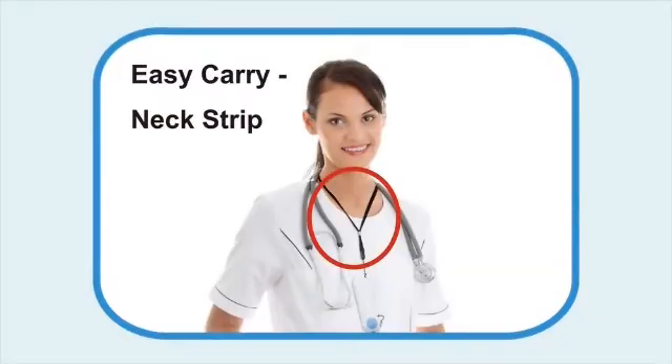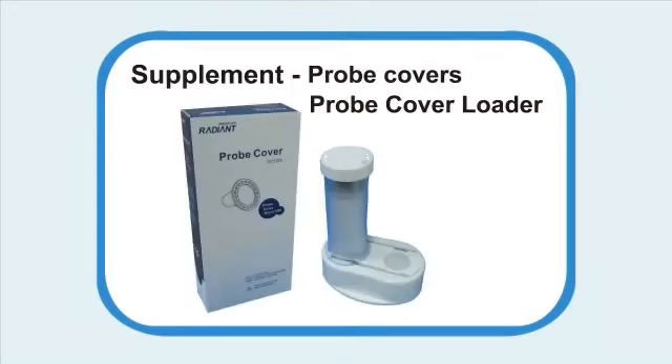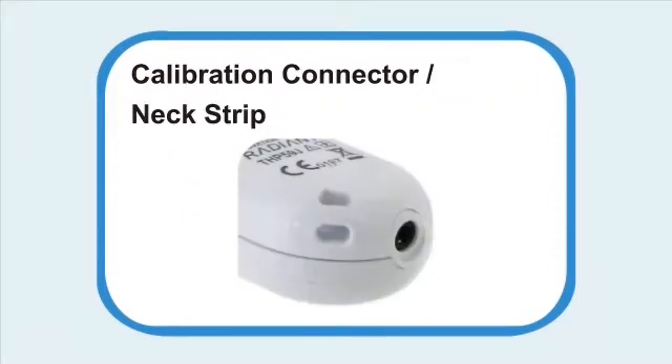Easy carry neck strip. 1 second ear measurement. Supplement probe covers with probe cover loader. Calibration connector neck strip.